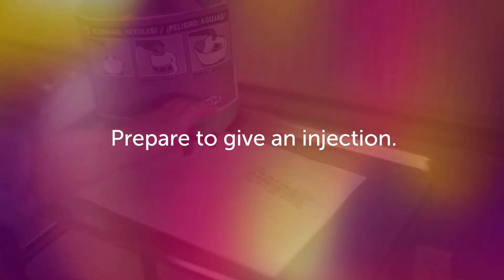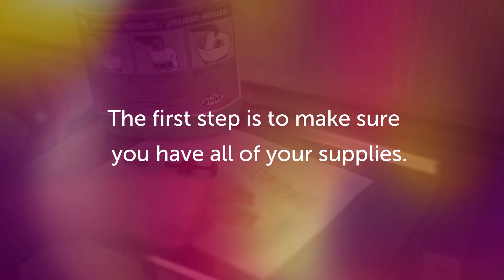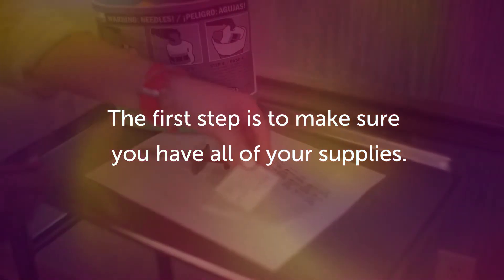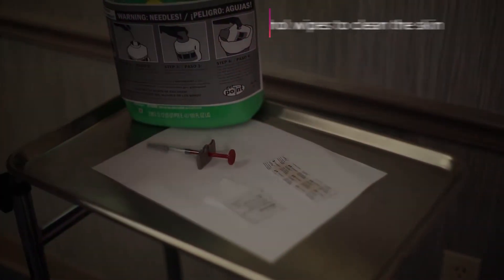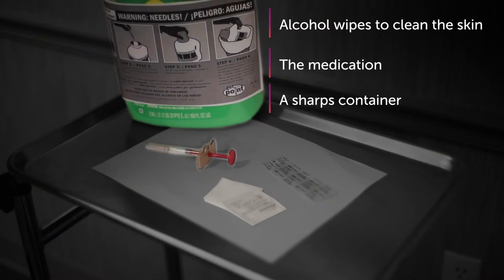Prepare to give an injection. When preparing to give an injection, the first step is to make sure you have all your supplies: alcohol wipes to clean the skin, the medication, a sharps container, and a band-aid just in case.